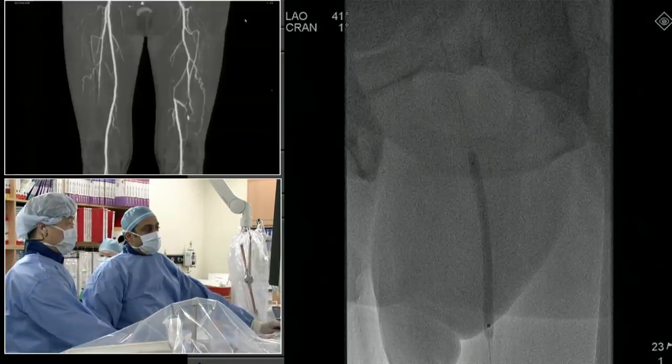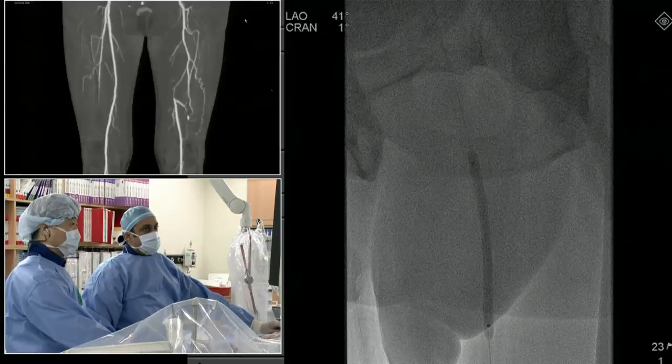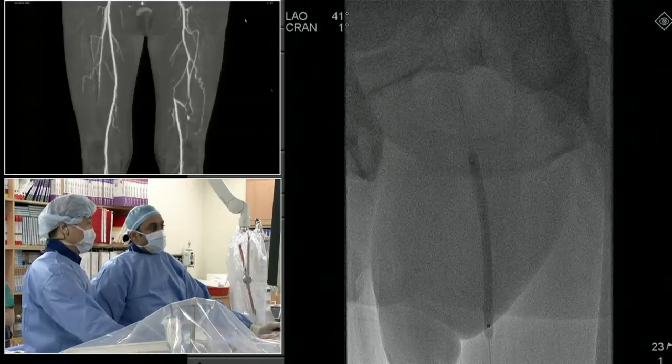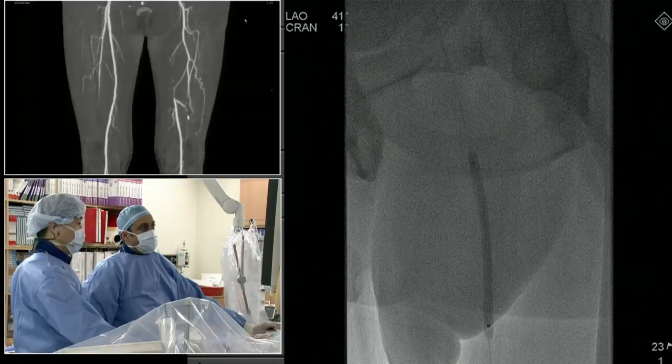Lawrence, you've done a lot of atherectomy. Let me just ask you, in what you saw after atherectomy in this lesion, could you have theoretically only treated that distal lesion with a drug-coated balloon and then either left the proximal aspect alone after atherectomy or used a bare balloon?